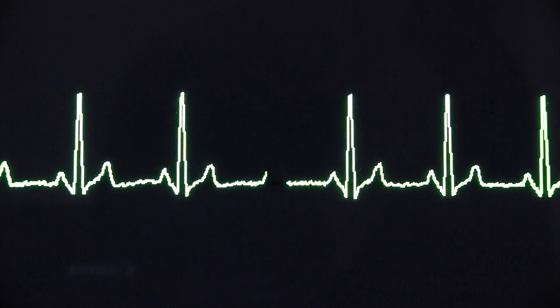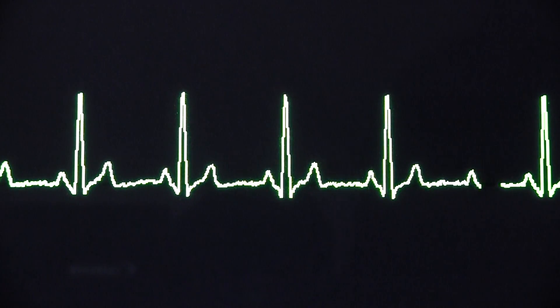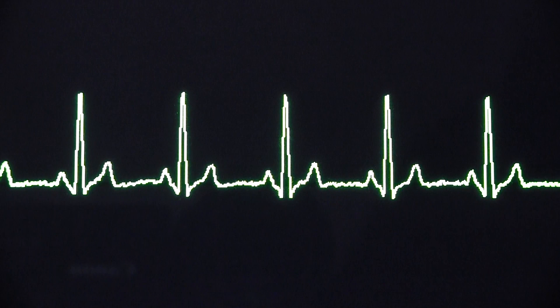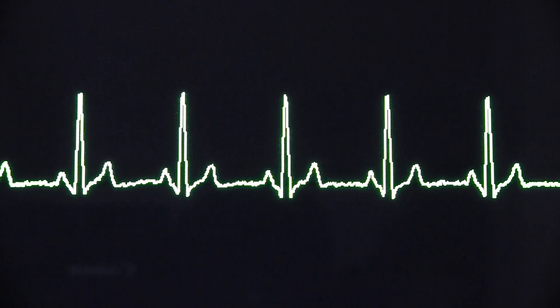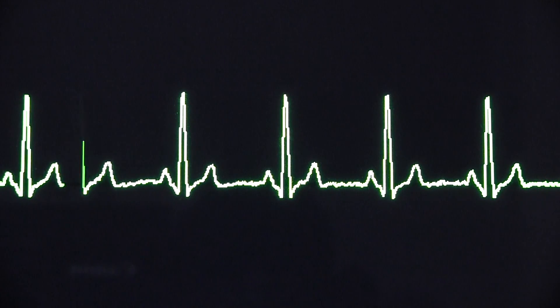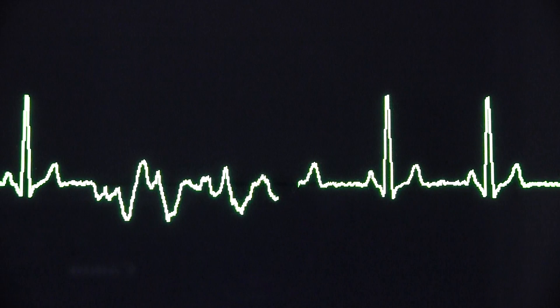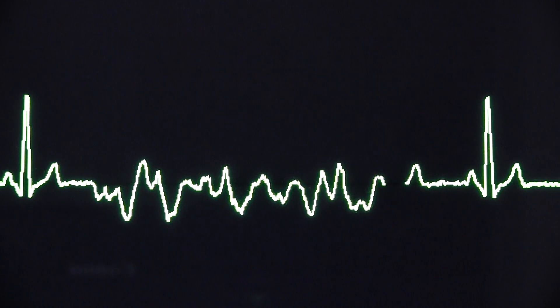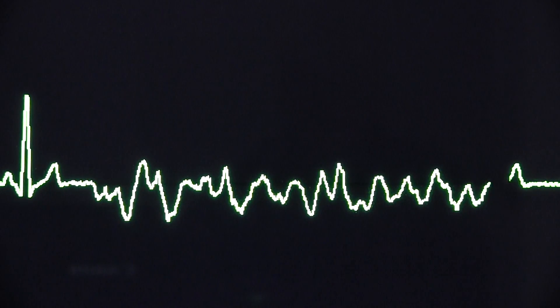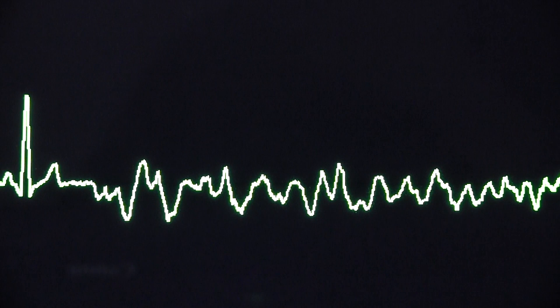So this patient's in sinus rhythm at the moment. Let's just keep an eye on it there. Now the patient's now gone into ventricular fibrillation.